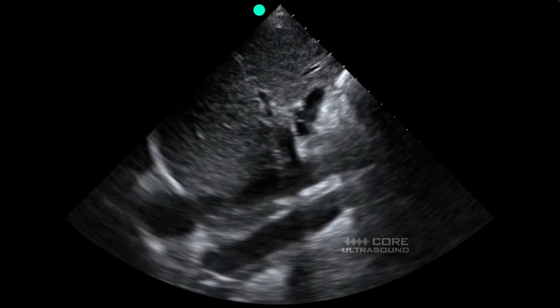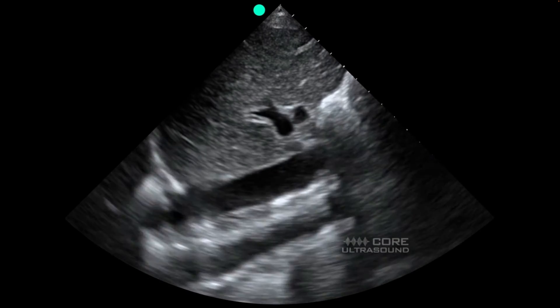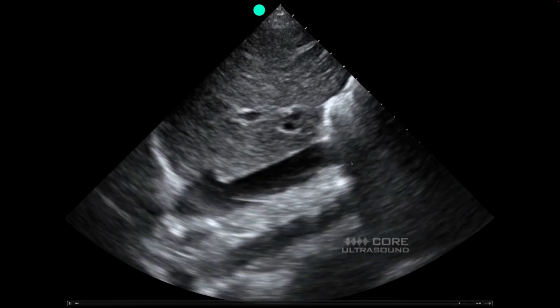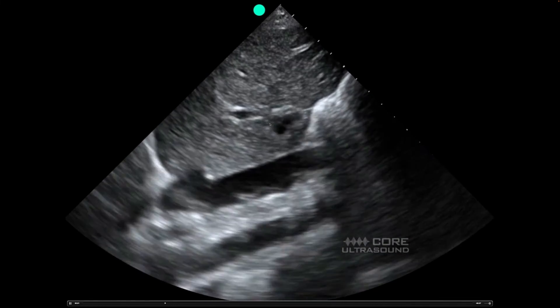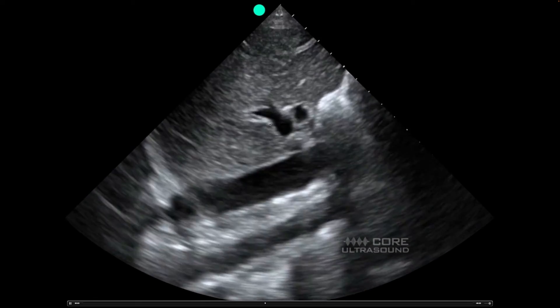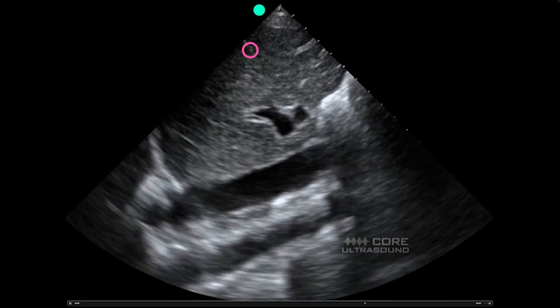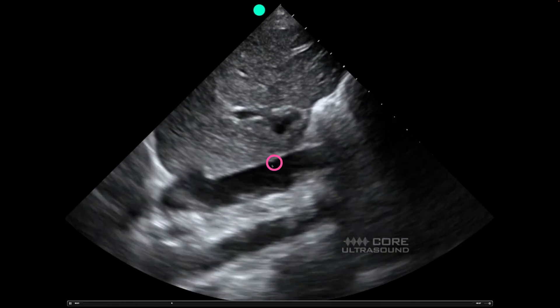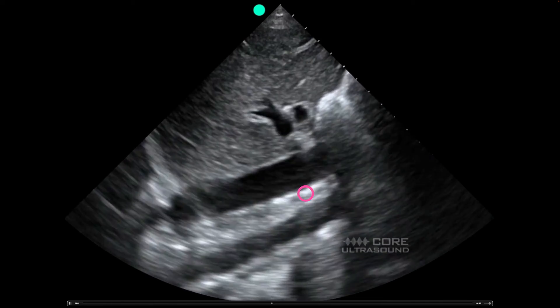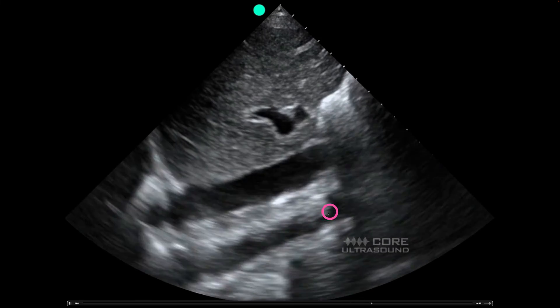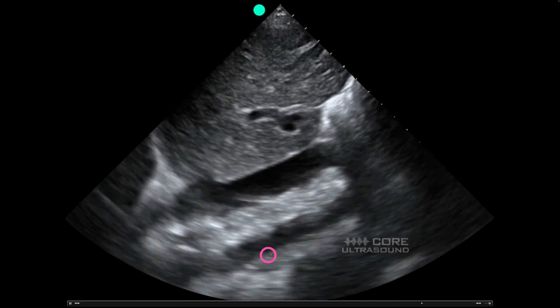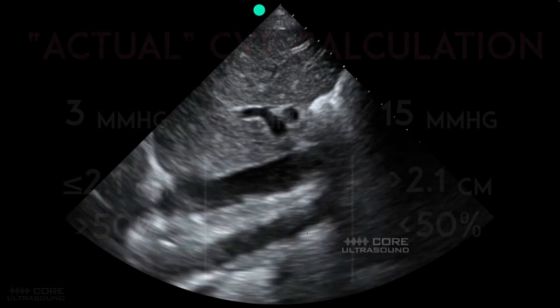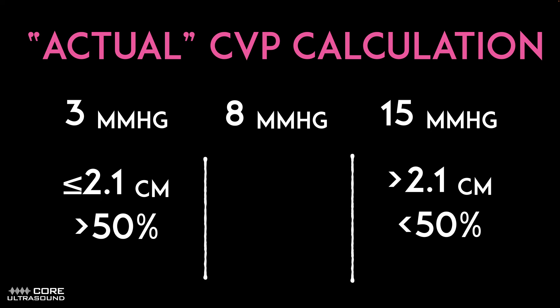If you're having trouble identifying the IVC in the subcostal window, you can do a transhepatic approach. It's not quite as robust in terms of the data behind it compared to the subcostal, but it works. We shoot through the liver in the mid-axillary line — we can see the IVC here, and on this specific view we have a bonus: this is the aorta as well.